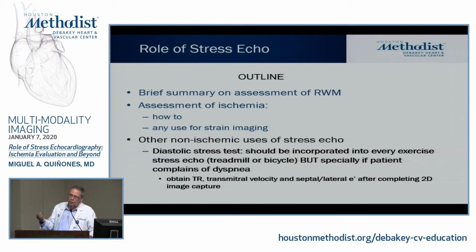So I would like to suggest that we make it sort of a routine that our sonographers, both at Fondren and in our clinic, routinely incorporate this because it's free data. And if the patient's symptom is primarily dyspnea, this should be really mandatory. So I wanted to finish with that because I feel very, very strongly about this. I mean, it's data that is available. It takes very little extra time.